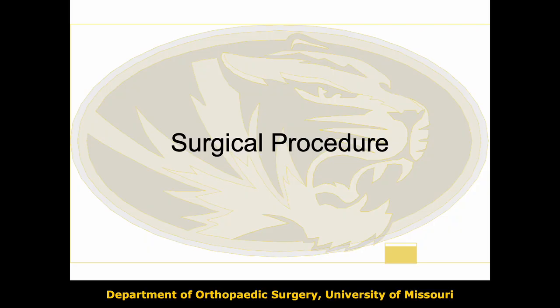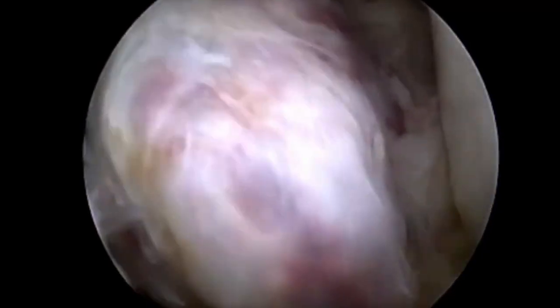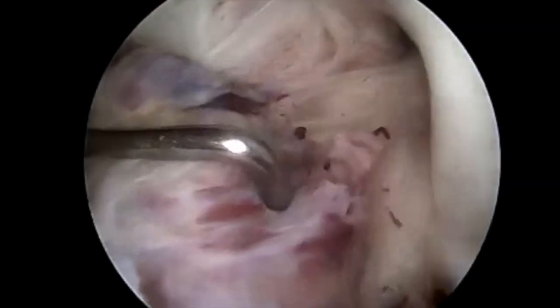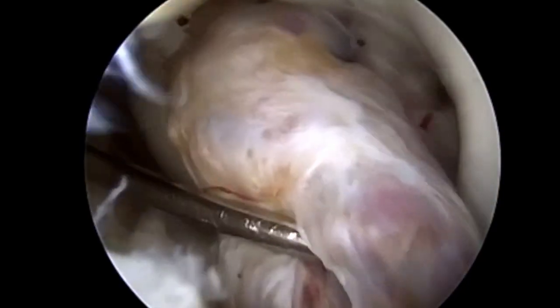The surgical procedure was performed with the patient in a supine position on a flat table. An EUA was performed, which confirmed an extension lag of 10 degrees. Standard anterolateral and anteromedial portals were established, and a full diagnostic arthroscopy was performed. This revealed an intact ACL graft with extensive fibrosis just anterior to the graft.